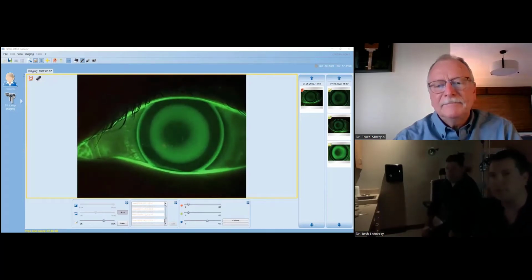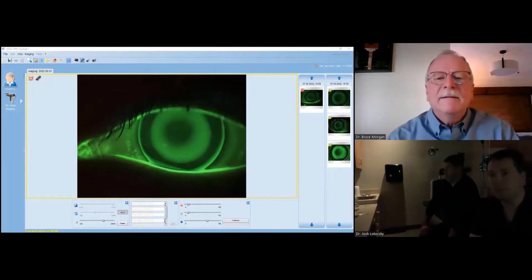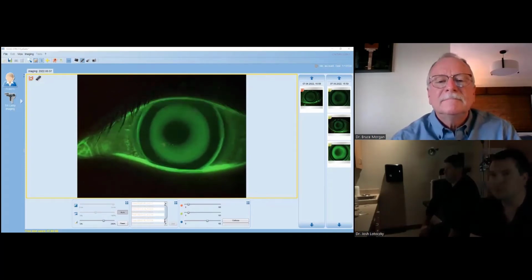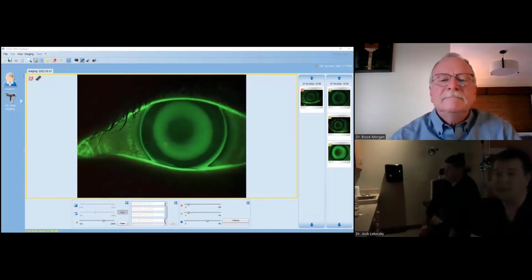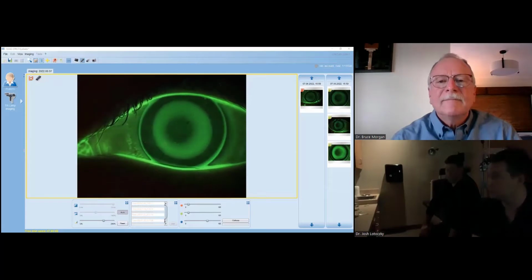Depending on how you have your practices set up, you don't necessarily want to evaluate the lens right after you put it on and right when you put the fluorescein in, because most people tend to put too much fluorescein in, and you get a misconception because you end up having fluorescein sitting on the front of the contact lens, and it gives you a false fluorescein pattern. And we certainly had that with this one, since we pulled the slit lamp up immediately after putting fluorescein in.